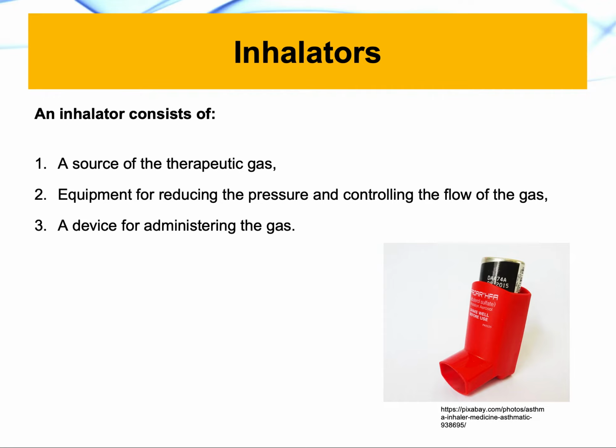From a biomedical engineering point of view, we would like to be able to optimize these components of the inhalator, and there are a lot of designs and products available. As an engineer, you can look at these products and find out what challenges or problems exist in each of them, and then we can come up with a need statement and design a better inhalator to provide a solution for these challenges.